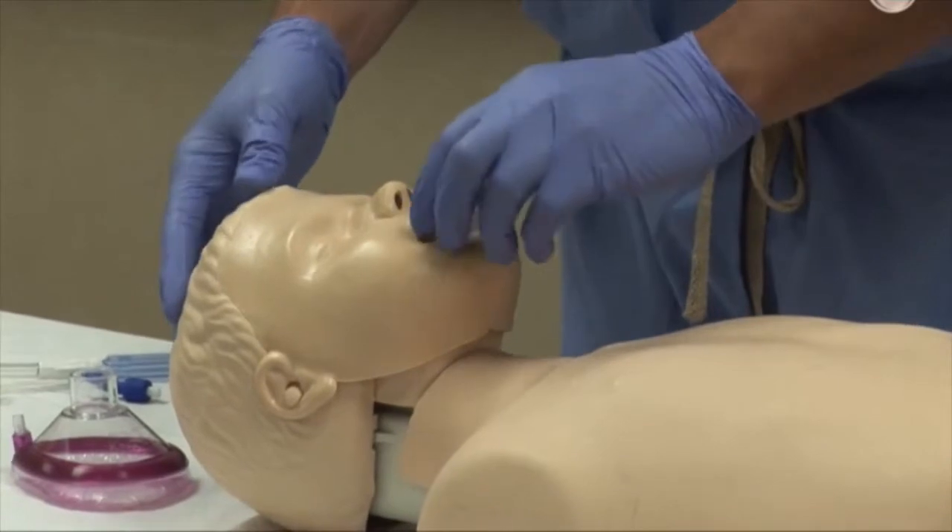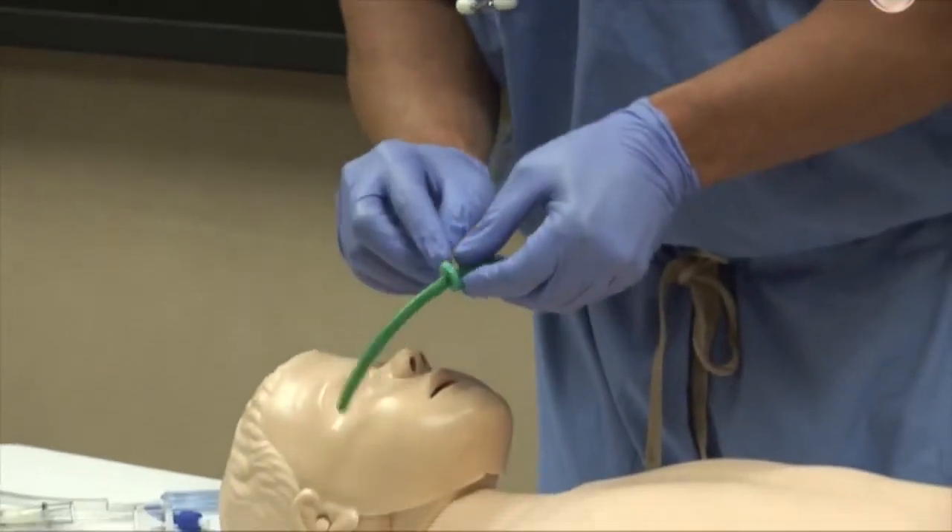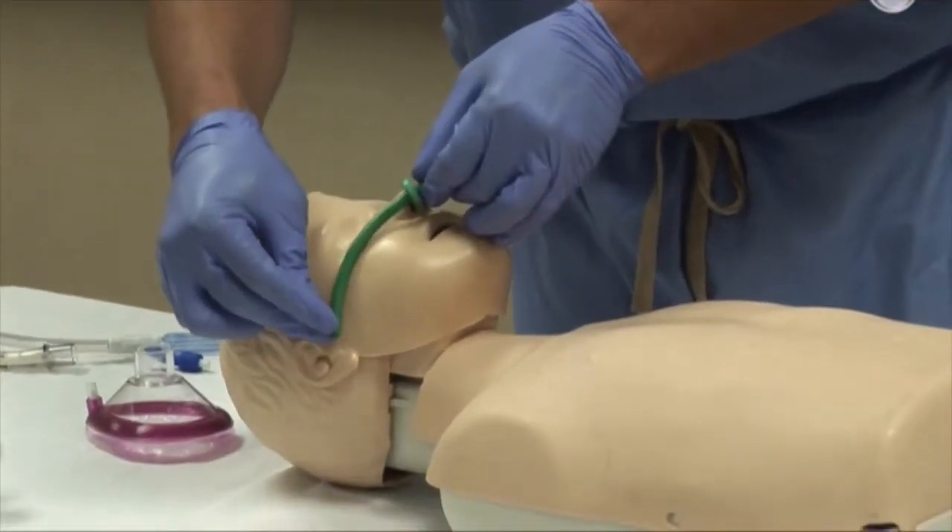Selection of the proper sized nasopharyngeal airway is done by assessing the flange at the nostril, and the tip should reach the tragus of the ear.